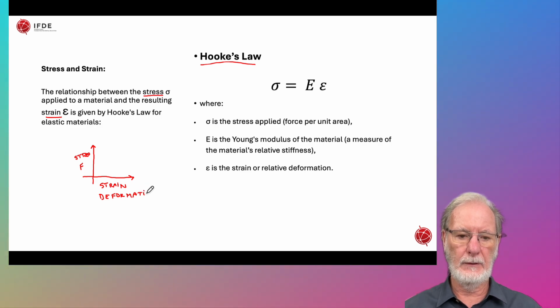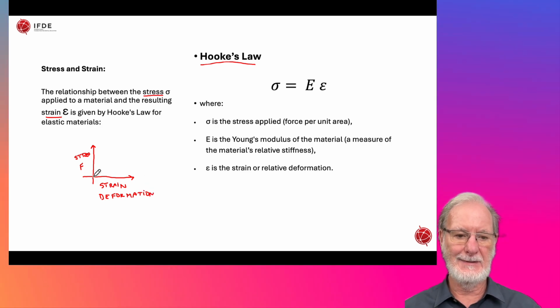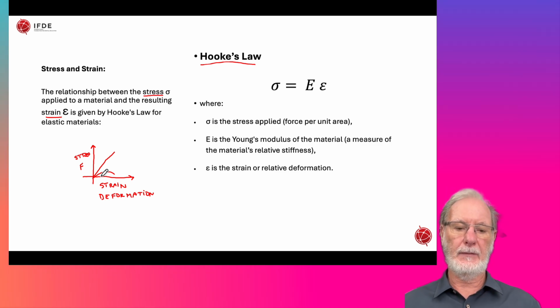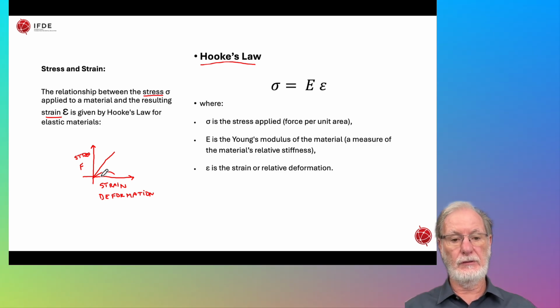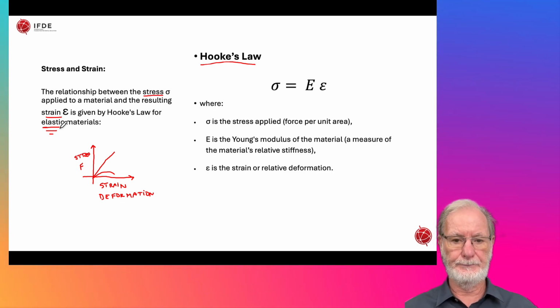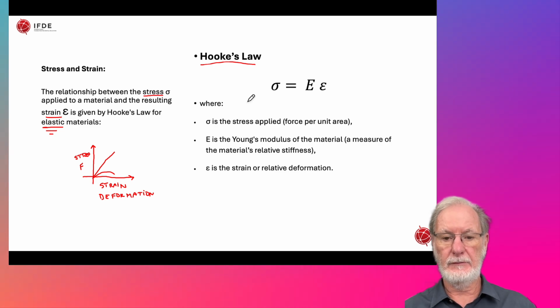every single material we use has a specific stress-strain curve. It could be completely linear, it could be this way. So many materials can be obeying Hooke's law because all materials are not necessarily fully rigid, so they have elastic properties that are taken into advantage. The best example would be nickel-titanium wires for fixed orthodontics, and obviously aligner materials for aligner orthodontics. So we're going to apply the stress, which will translate into a force per unit area, which becomes a pressure.